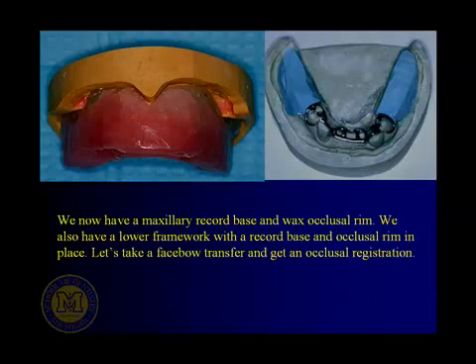Now, some faculty will say, don't bother to make these temporary bases until you've tried the framework in the mouth. So if, when you try the framework in the mouth, it seems that it doesn't seat very well or there's some interference, you're not confused as to whether these are causing it not to seat. So if you try the framework in the mouth with nothing on it and make sure the framework seats okay, it only takes a couple of minutes to make these, so that's not a big issue.